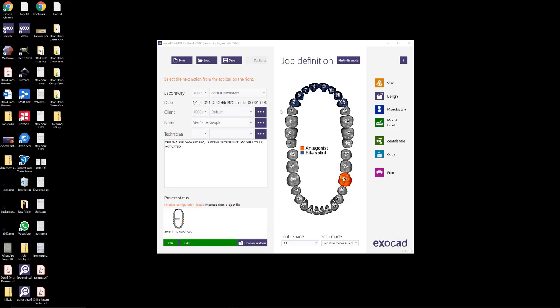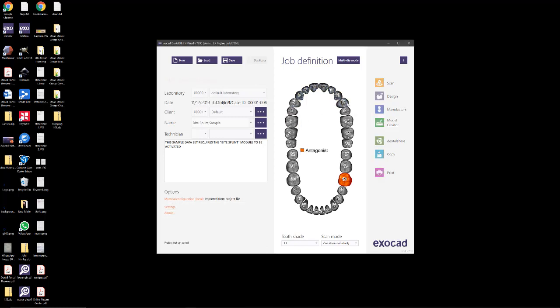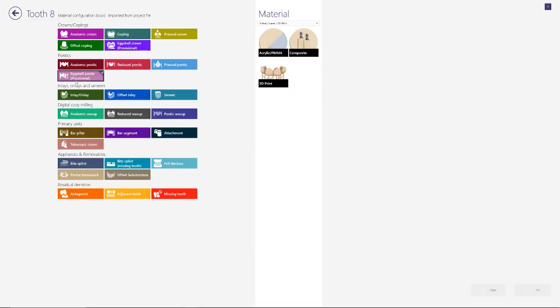Alright, so just to show you how to do this, I'm going to use the bisplint demo case. The first thing I'm going to do is modify my restoration types, and I'm just going to show you how to do this on the centrals. The concept will be applied to as many teeth as you want.